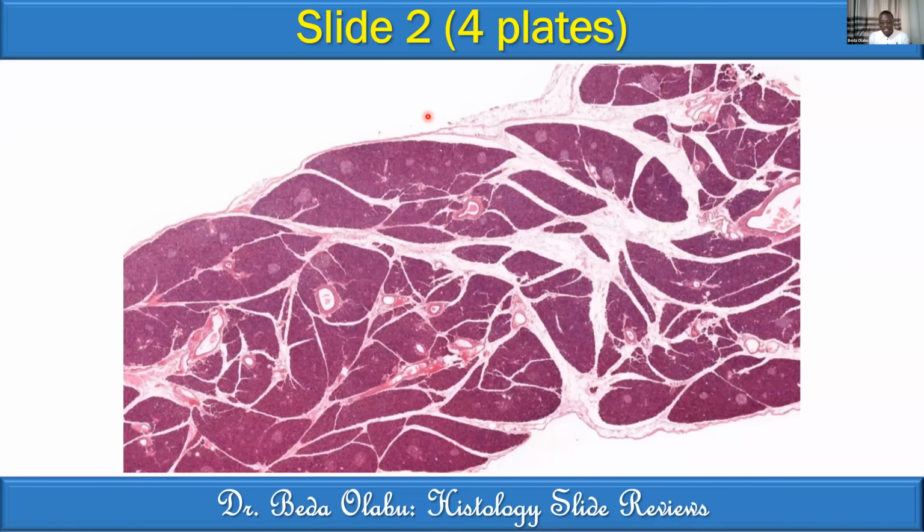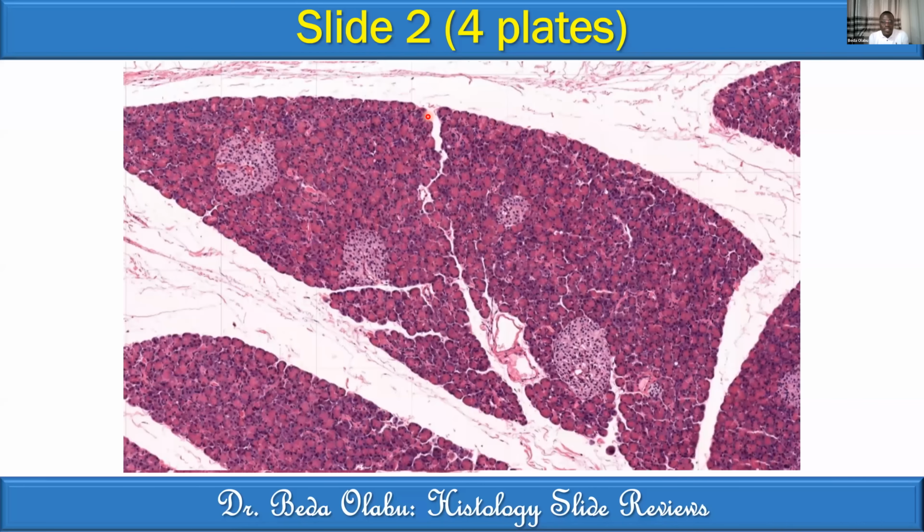Right, I believe you've done that for that level of magnification. Now that is the second level of magnification. Add to your list what is new or confirm the previous one. Another 30 seconds for that one.